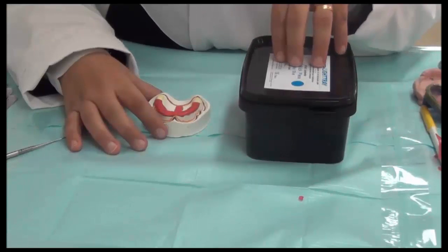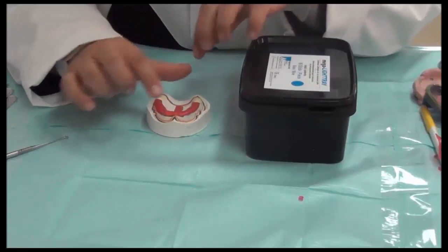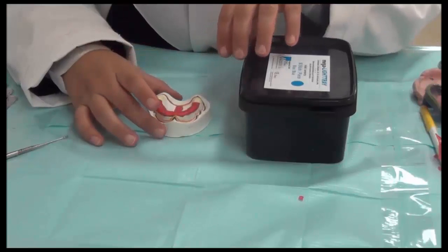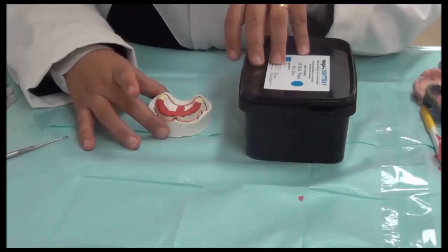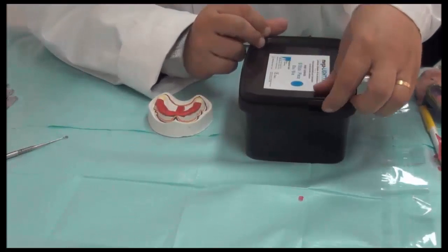For students' purposes, we use the light cure because it has an advantage that it's pliable for a long time. You can work, you can modify, you can add and remove while still having time. And once you have finalized your shape, you can light cure it to become solid. So it has more working time.